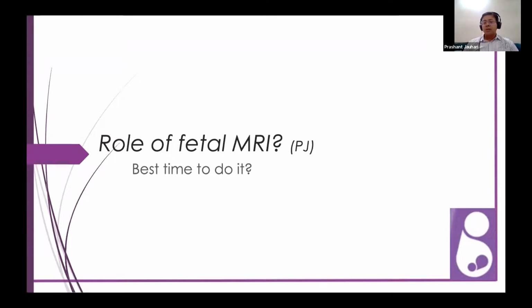And sometimes people have studied that yes, there would be 5 to 10% chances that they have negated what was falsely diagnosed as a partial agenesis of corpus callosum based on a neurosonogram. So in that way, I will recommend, and in fact, the ICOG has also recommended fetal MRI as a part of evaluation for agenesis of corpus callosum.